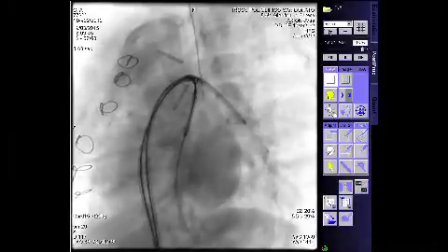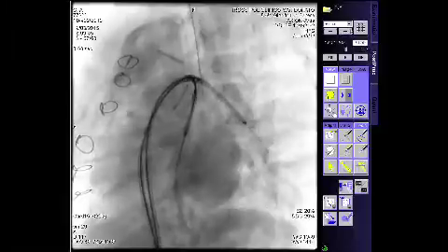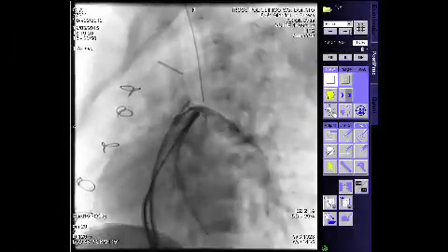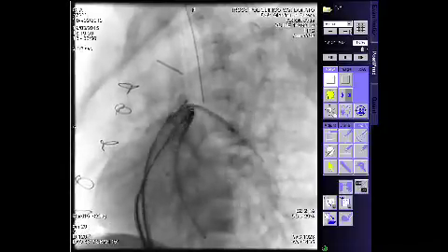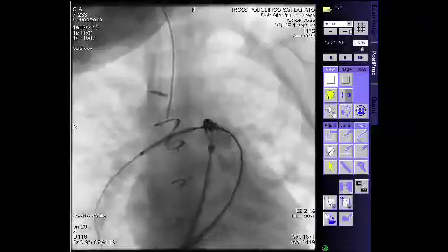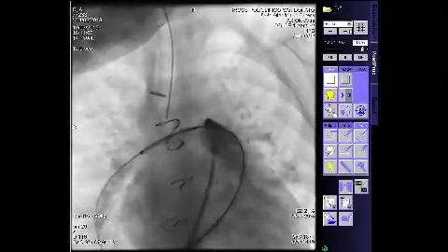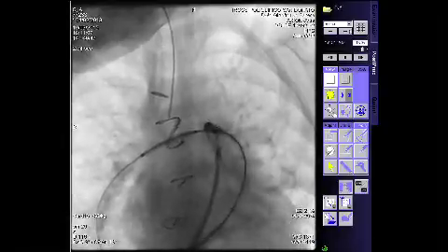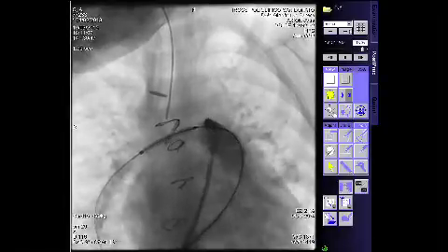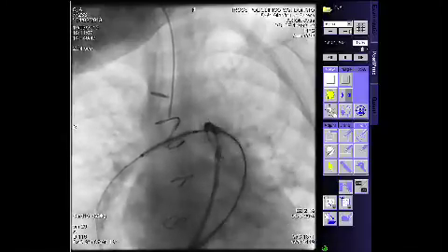And after this, you are protecting with the wire the region of the opposite branch. We save this approach only with severe distal stenosis of the pulmonary trunk. But you have enough space, up to you. Okay. So I think I should go first for the left.